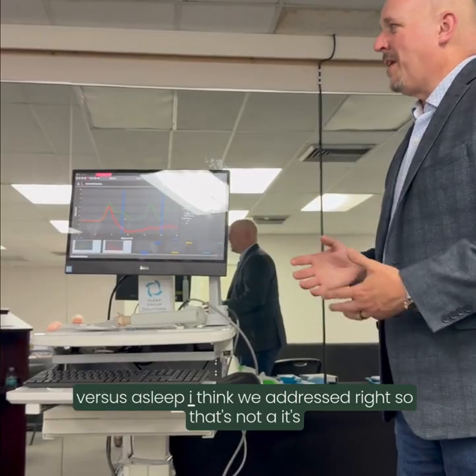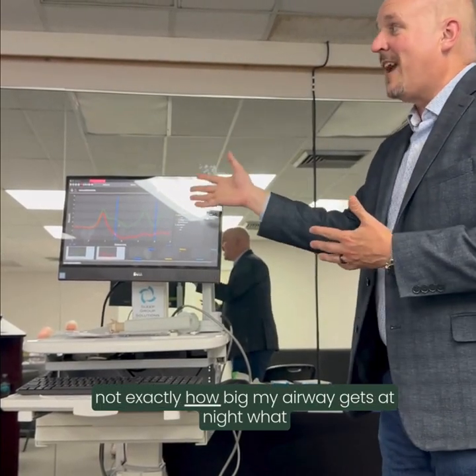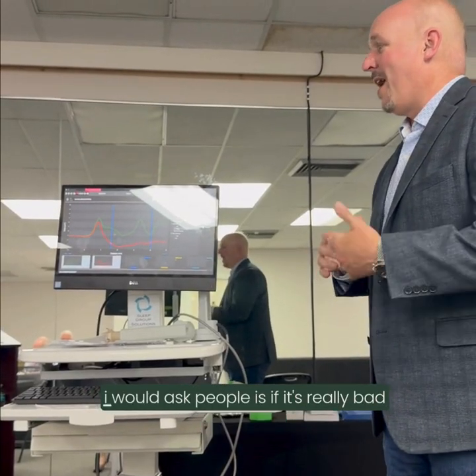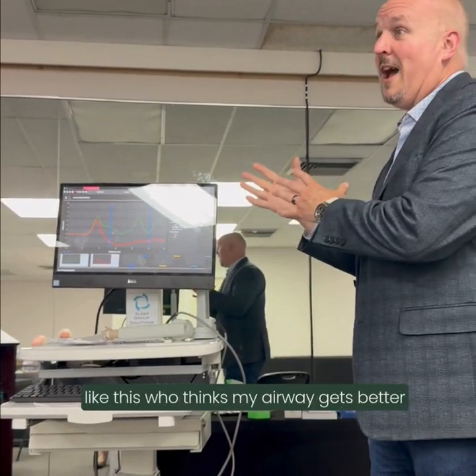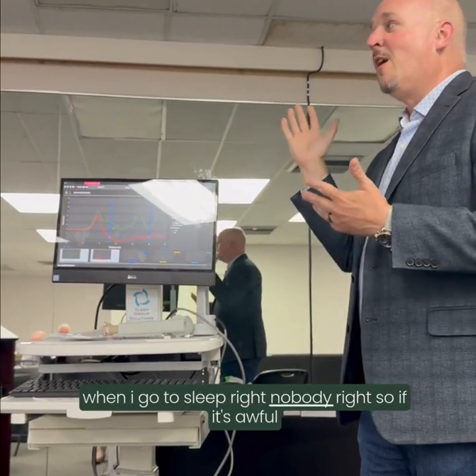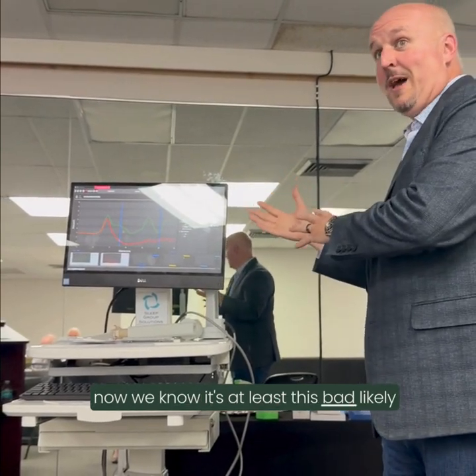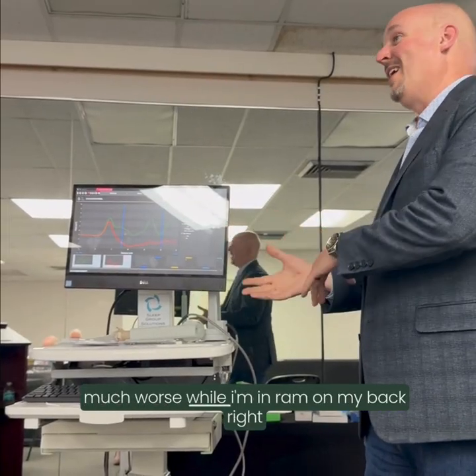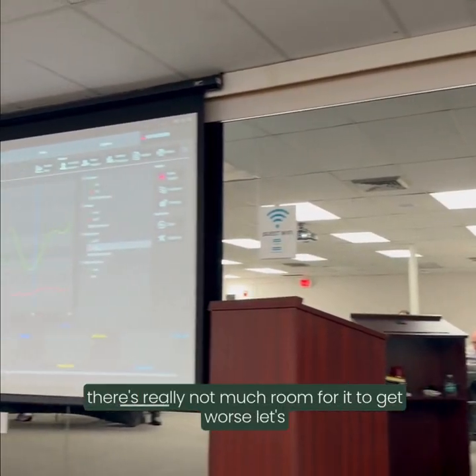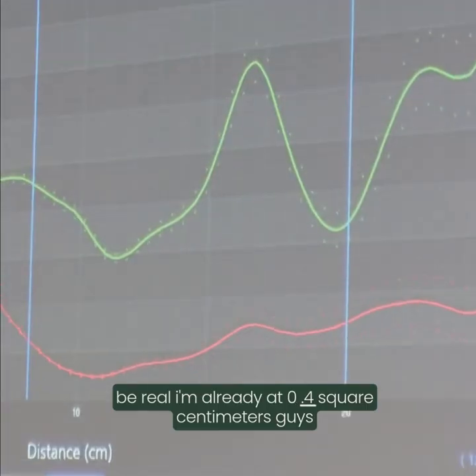Awake versus asleep, I think we addressed, right? So it's not exactly how big my airway gets at night. What I would ask people is if it's really bad like this, who thinks my airway gets better when I go to sleep, right? Nobody, right? So if it's awful now, we know it's at least this bad, likely much worse while I'm in REM on my back, right? There's really not much room for it to get worse, let's be real. I'm already at 0.4 square centimeters.